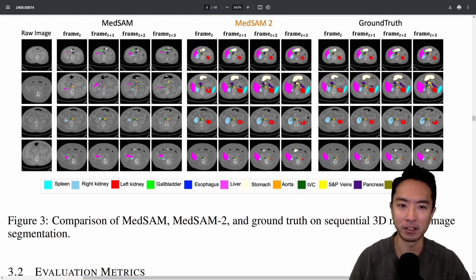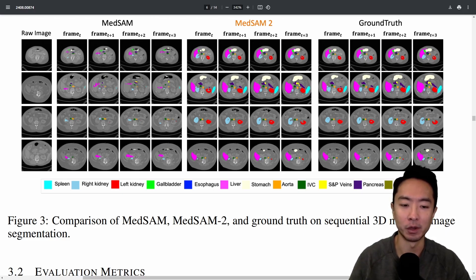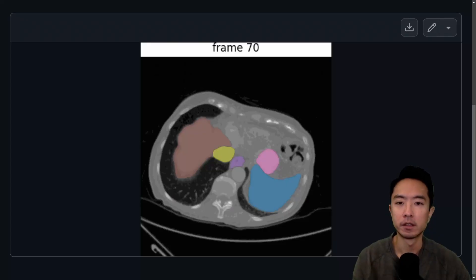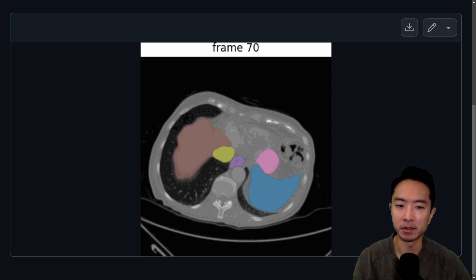The model can also expand to other medical image datasets. If you want to play around with it, go ahead and check it out on their GitHub. Here is one of the examples they provided — if you refresh the page, you can see it run in real time.